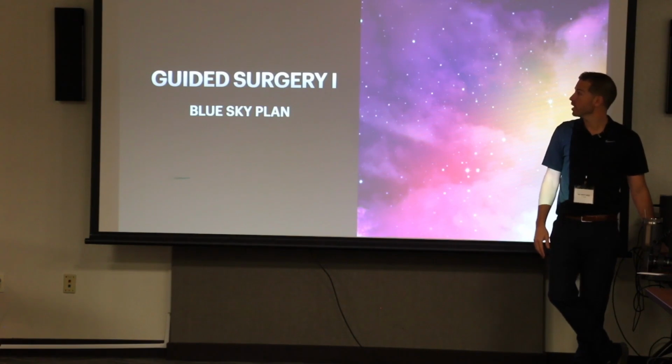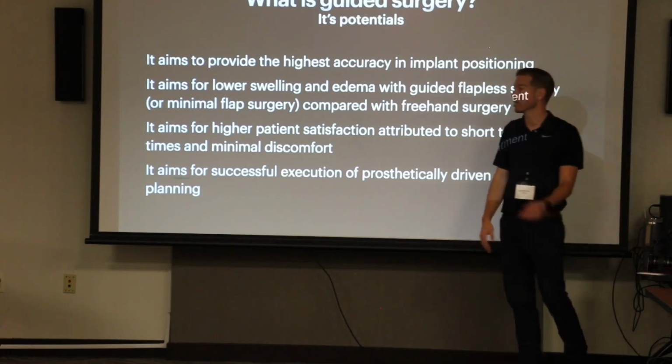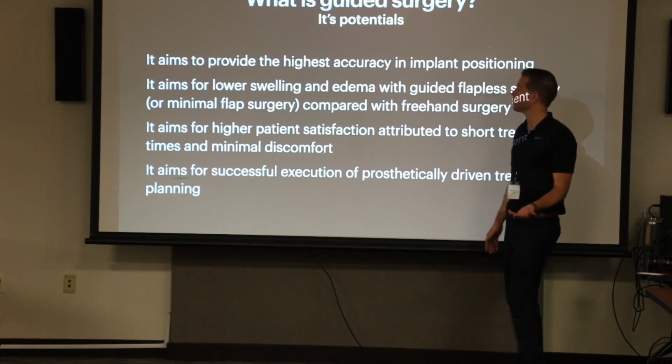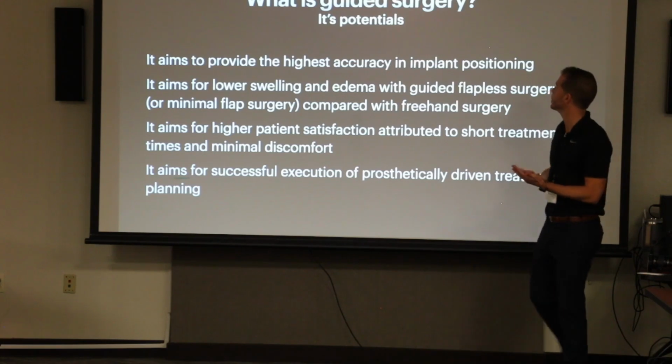So today is all about guided surgery, because you guys are all going to go home and you're going to start doing these things in your practice, or your team members are. So what is guided surgery? It aims for accuracy and predictability.